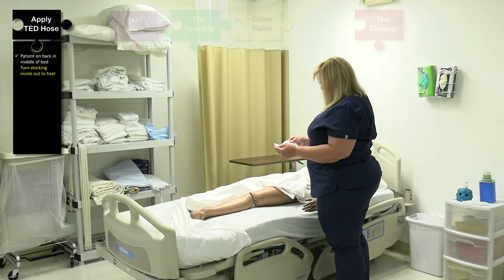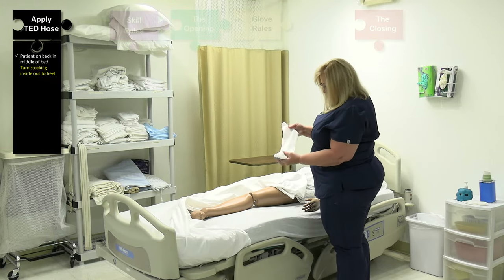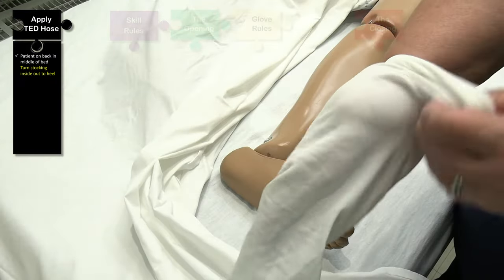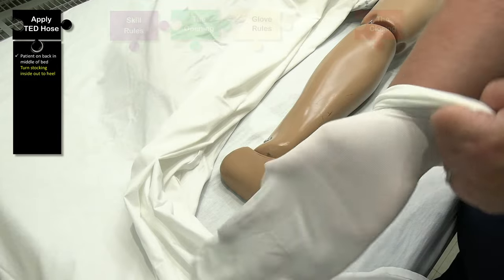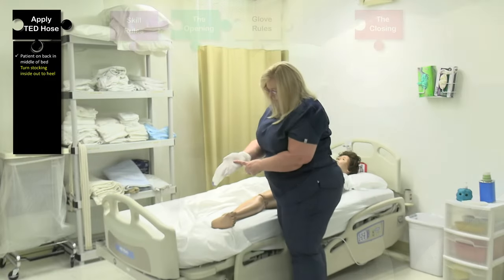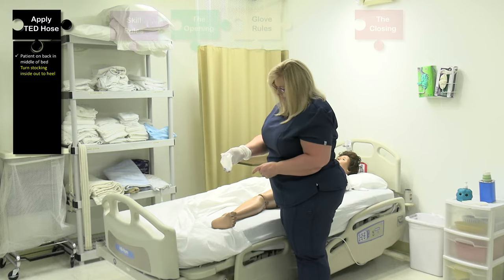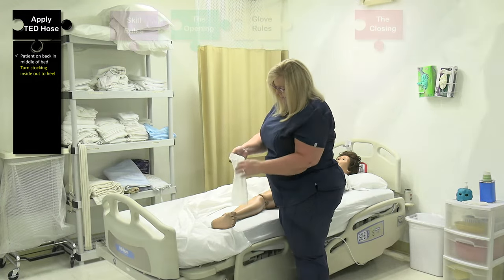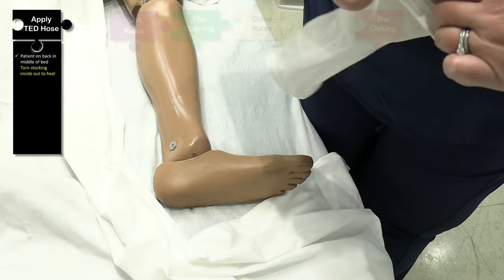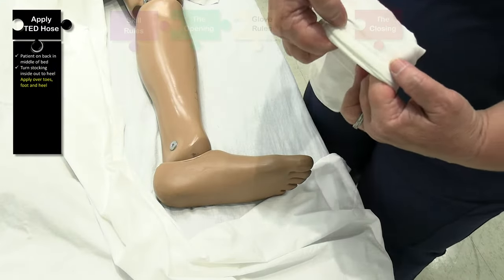To appropriately apply TED hose, we need to look for the heel. The heel of the TED hose is going to have a square around it. Here on the bottom, you can actually see the square. So the heel is in the palm of my hand. I'm going to hold that and pull this inside out just until I get to that heel square, like that.